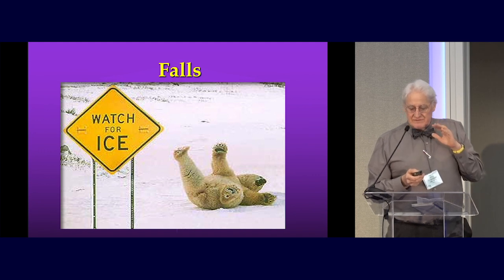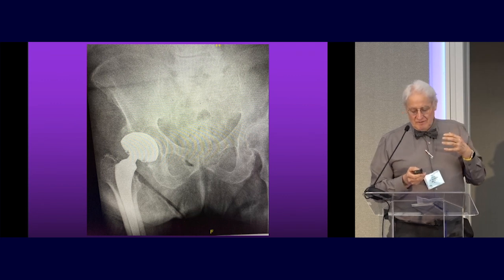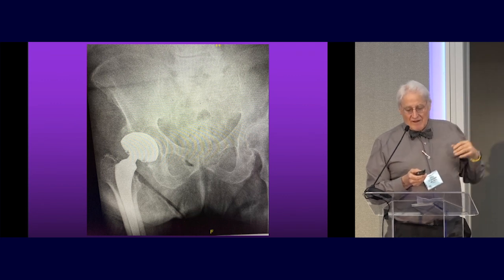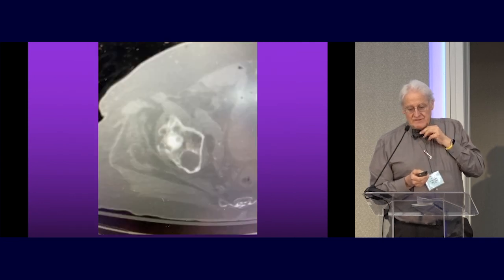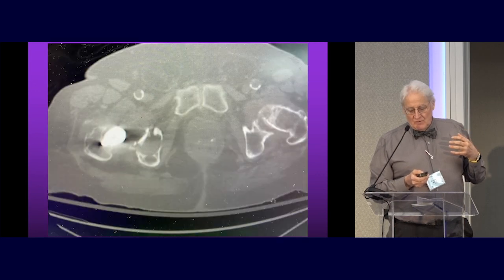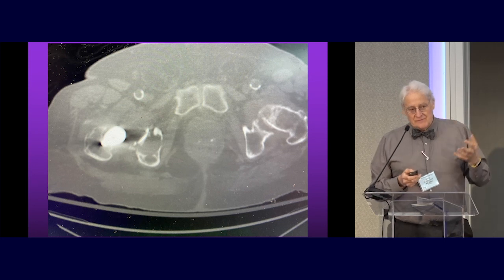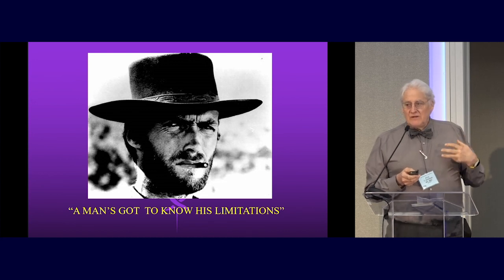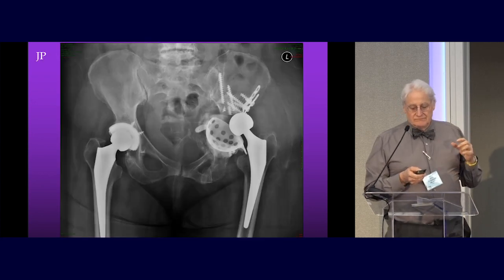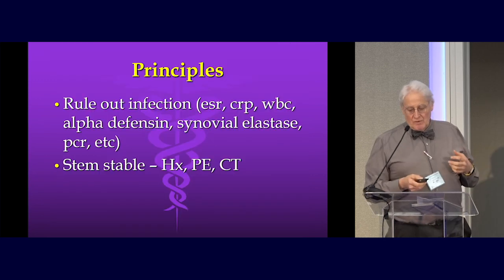Often it just happens from falls. This is a fall that has a fracture, but you can see there's some lysis around that cup, and we'll show you some more evidence of that. And here's the CT. So there's already a problem developing, and if you go a little bit inferior, you see the acute fracture that caused the pain. But this is something that had already started. Whether you take these on or not, they can be difficult, but I don't think they're really unmanageable. The problem happens when this whole thing starts going inward.